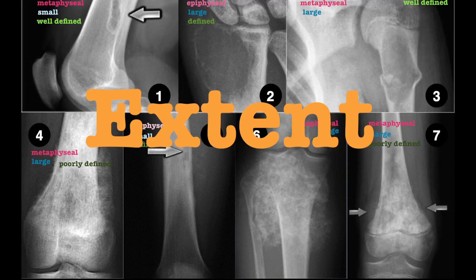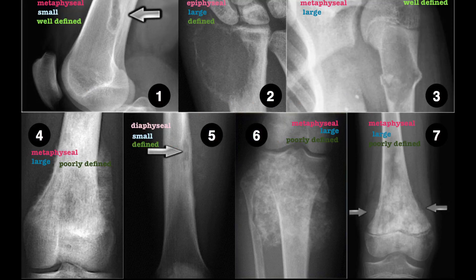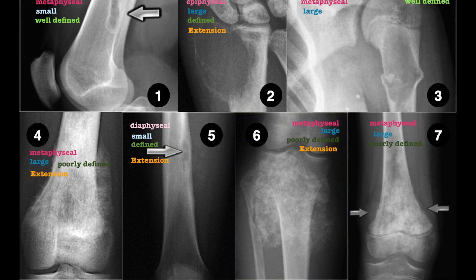E is for Extent. Think malignancy if there is evidence of extra-osseous involvement. There is likely extra-osseous involvement in figures 4, 5, 6, and figure 2, which shows some locally aggressive behaviour — there is a wide zone of transition towards the marrow and extension of the lesion to the metaphysis.